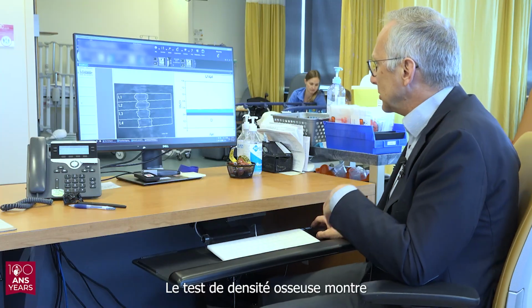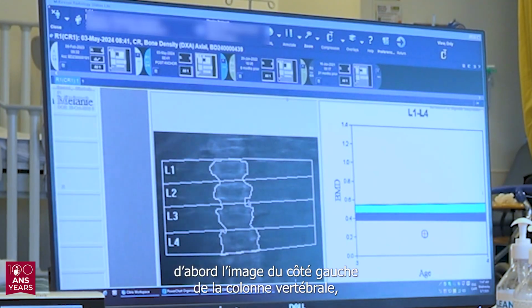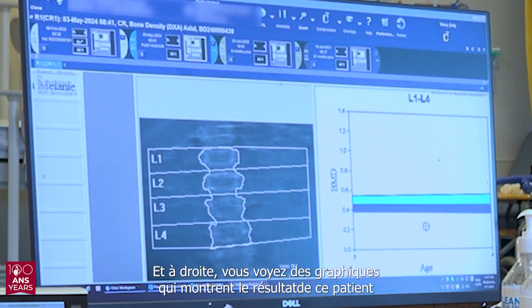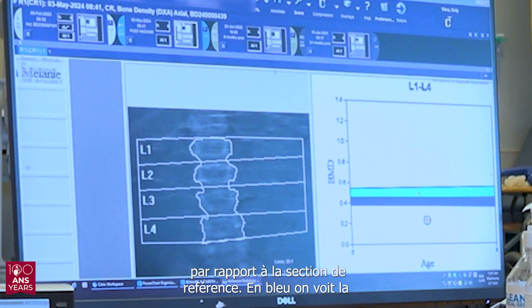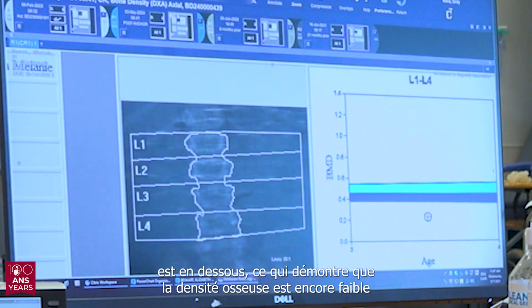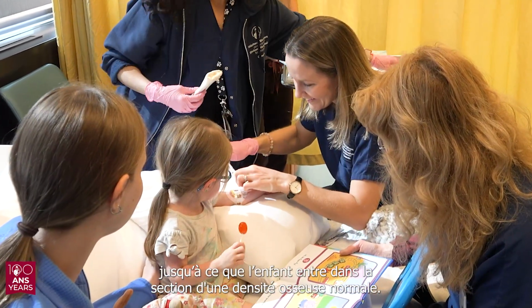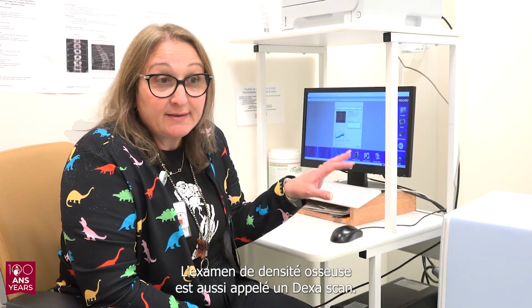The printout here from the bone density test shows you first the picture on the left side of the lumbar spine and where the bone was detected by the computer. And then on the right side, you see the graphic that shows the result of this patient compared to the reference range. So in blue is the lower part of the reference range, so the result of the child is below that. So that shows that the bone density is still low. And we can continue the treatment for a while until the child will enter the normal range with the bone density. Bone density is also called the DEXA scan.